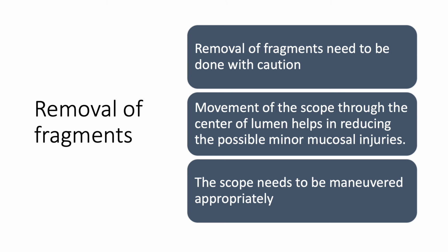Next important concern will be removal of fragments. Sometimes we have more fragments to remove. Luckily, the focus is now being shifted to dusting of stones, which leaves very few removable fragments. Even then, you might need to remove stone fragments on some occasions. There are two concerns in stone removal. One, avoiding mucosal injuries. Second is multiple re-entry. Here, the scope needs to be kept in the center of the lumen to reduce the possible minor mucosal injuries due to stone or the instruments.